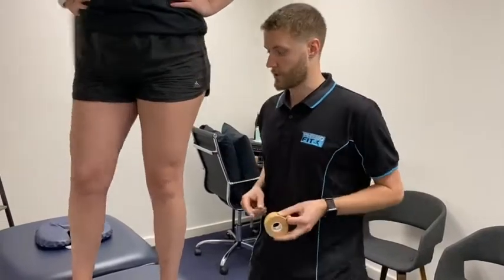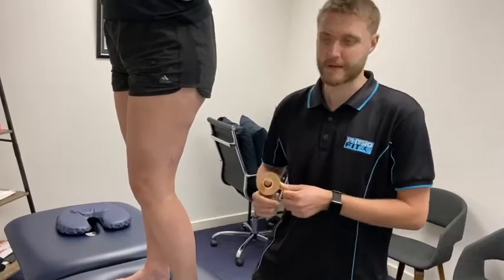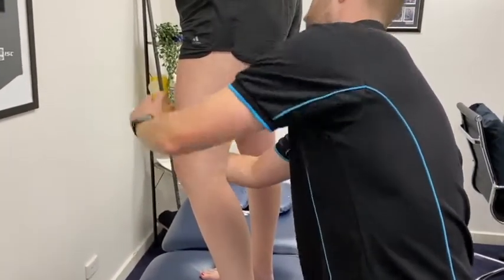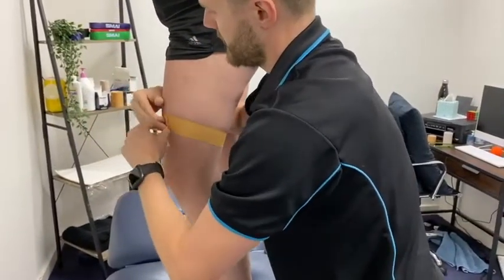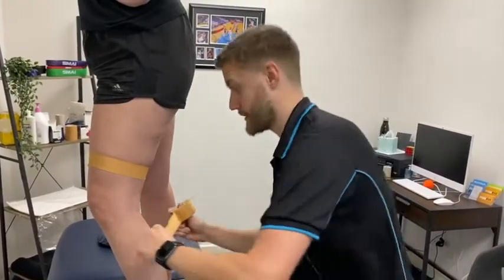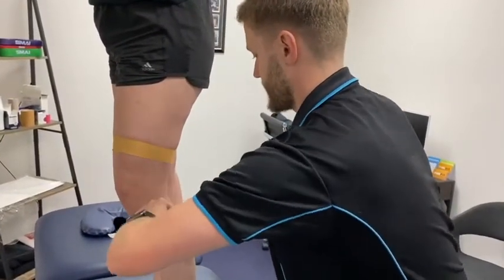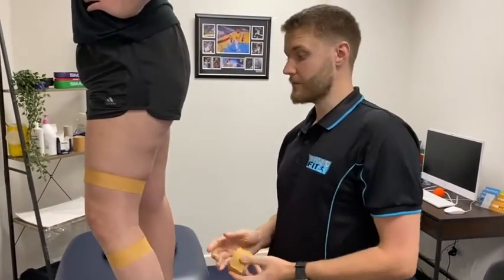I'll get Caden to face the wall and get them into just a little bit of knee flexion. Doesn't have to be a whole lot, just a bit. Then we're going to do a couple of anchors around the top of the knee and around the bottom of the knee. I've got Caden up on a table so I don't have to bend down too much, but you can do this with them standing on the ground. These anchors are put on with no tension at all.